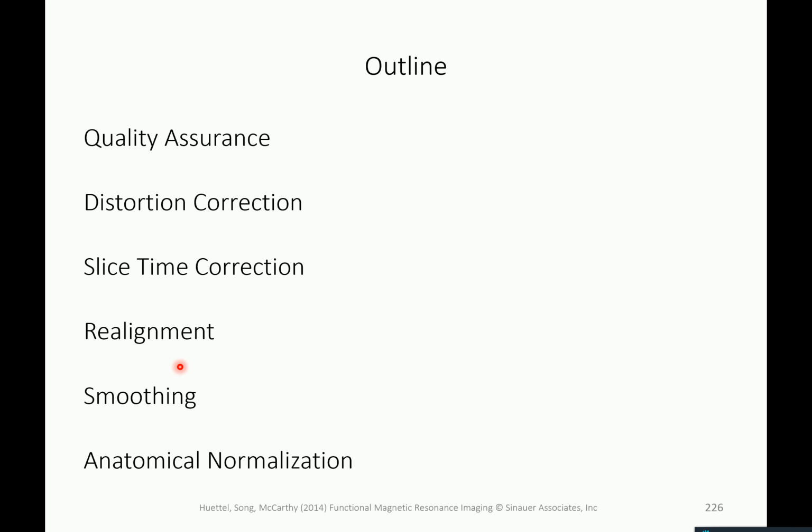But what I want to say, and this is also why I go over preprocessing quite quickly, is that I could also do a full course on computational anatomy. For the interpretation of fMRI studies, the preprocessing is not that important. The interpretation is completely determined by the statistical analysis that you do, whether a GLM analysis, a DCM analysis, maybe an MVPA analysis.